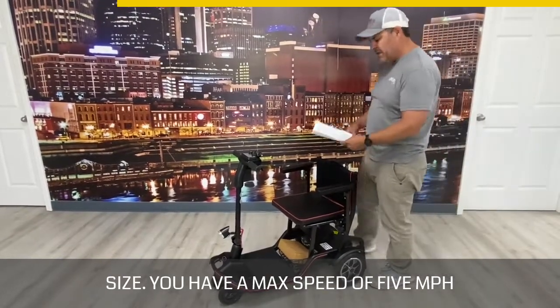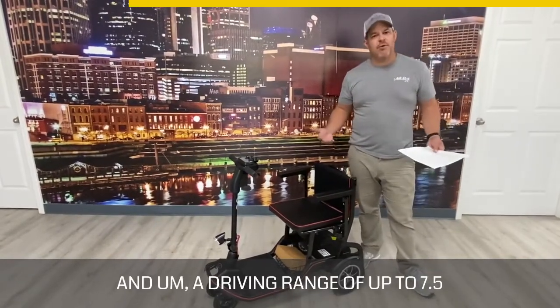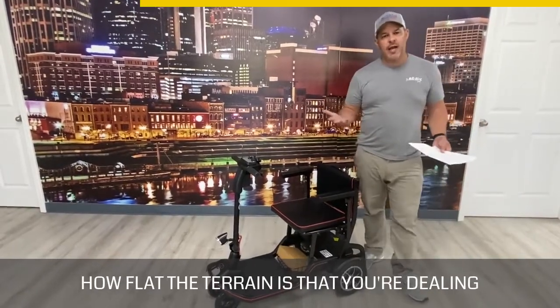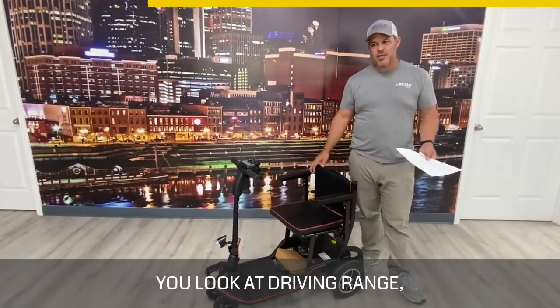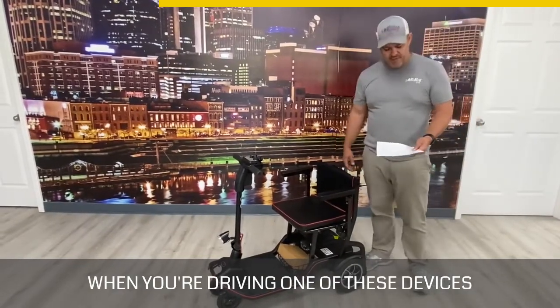You have a max speed of 5 miles an hour on this one and a driving range of up to 7.5 miles. Driving range can always depend on how much the individual weighs and how flat the terrain is, so always keep that in mind. But 7.5 miles is a pretty good distance to be traveling when you're driving one of these devices.